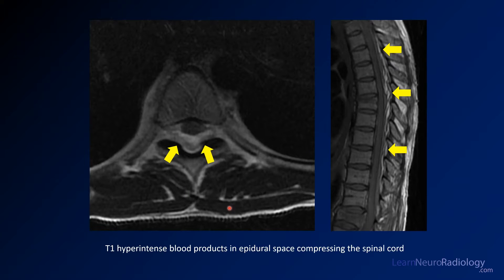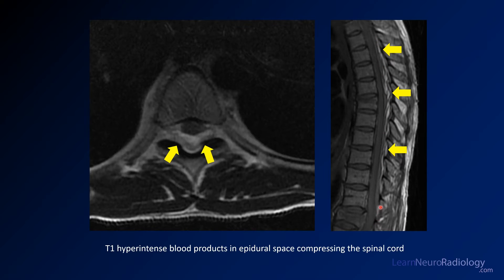On these T1 weighted images through the spinal canal, you can see there's something filling the dorsal epidural space. The canal is displaced ventrally. There's T1 hyperintense material filling the dorsal epidural space, as indicated by the arrows on the previous image. It is T1 hyperintense and very heterogeneous.